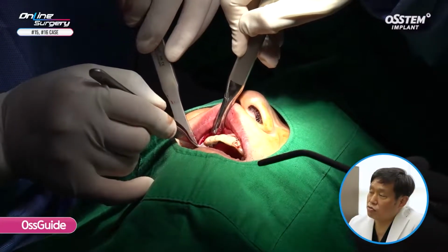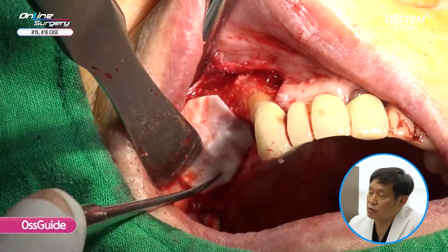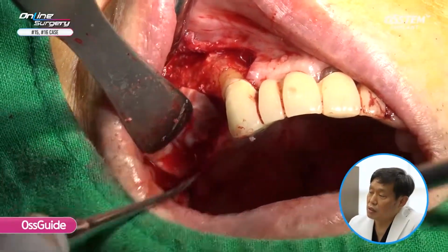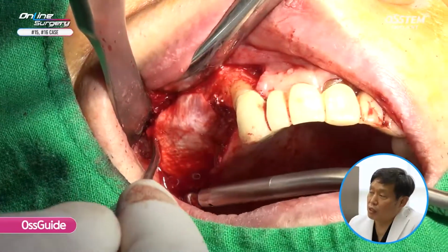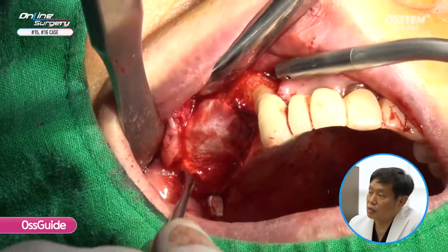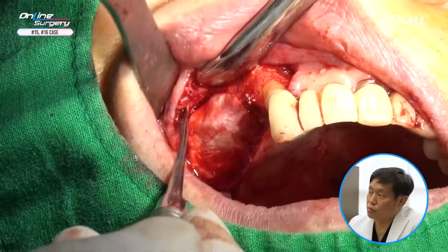You need to irrigate it using saline water. You put it below the palatal flap. Especially, you pay heed to number 16 where GBR was done. LAS KIT is used. Collagen membrane is used for coverage.